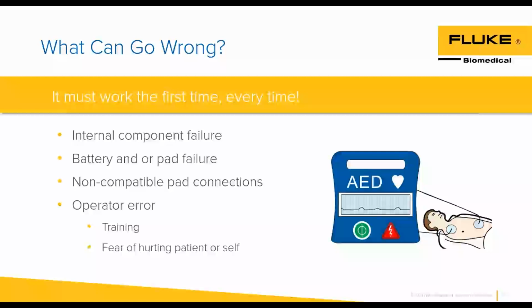I don't see this as much anymore as we used to, but people want to have that defib ready to go. So what they do is they take their AED pads and open them up so they can be plugged in. Well, as soon as you open up those AED pads, they're going to start to dry out. So just another consideration there. It might not be a mechanical failure with the defib. As you're doing your PM circulation and looking at these machines, are you seeing these other environmental conditions that might deteriorate the life of your defibrillator?